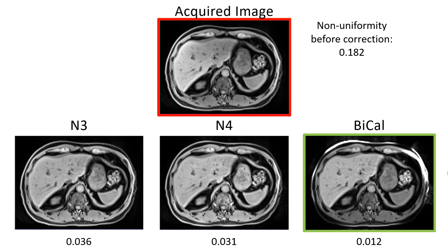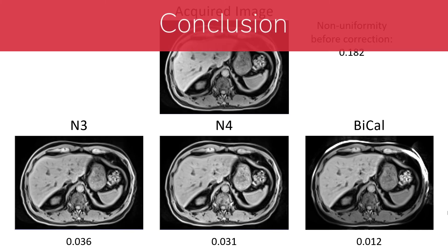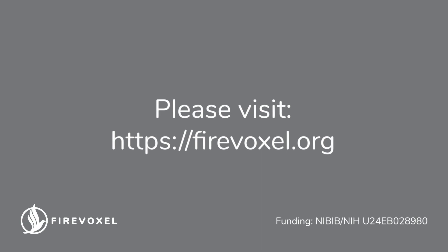Note that the BICAL correction preserves the contrast between the liver and spleen or muscle, whereas N3 and N4 methods reduce this contrast. This concludes this brief introduction into FireVoxel's non-uniformity correction tools. You can pick the most appropriate tool based on your application, required degree of correction, and processing time. For more information, please visit our website.